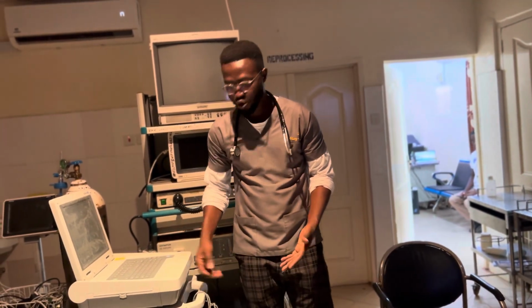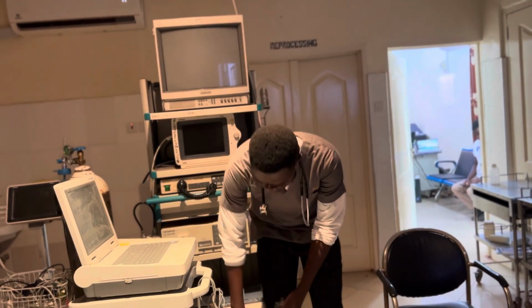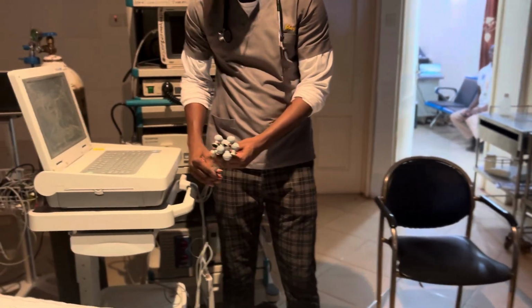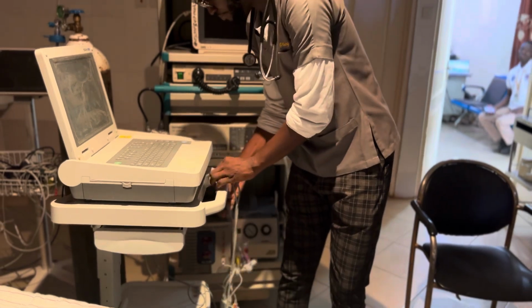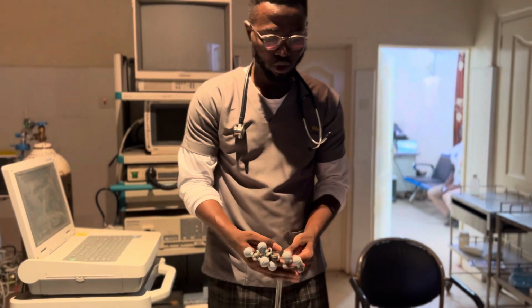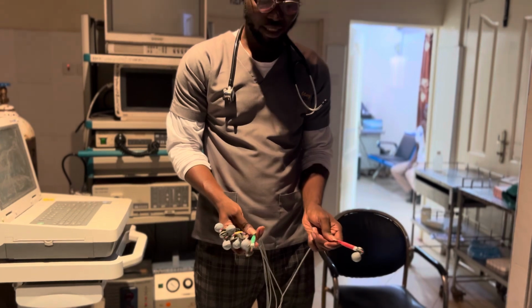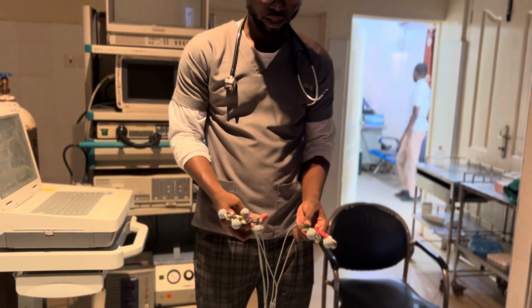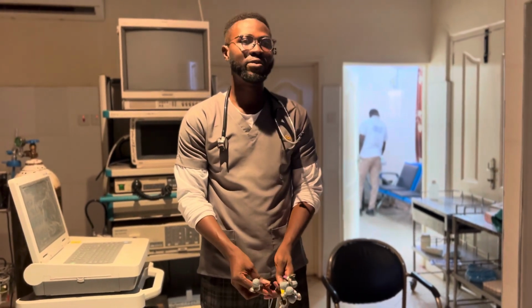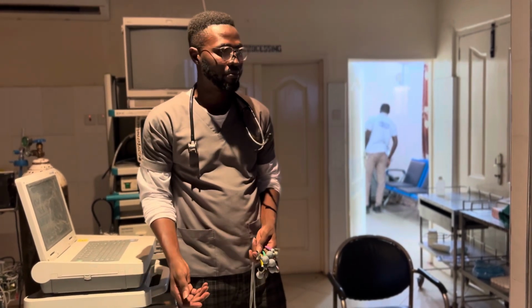Again, I said that you don't have to memorize the color because it has been inscribed on those electrodes. So look at this. These are the chest electrodes. Do you see that? I think I have to use this. These are the chest electrodes, just like I said. They can be named C1 or V1. Chest, so red, chest electrode, then C3, then C4, you have C6, you have C2, and then C5. All you need to do is inspect how they have been labeled, and then you know where to position all of them. Do you understand?